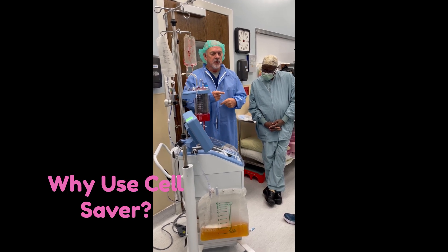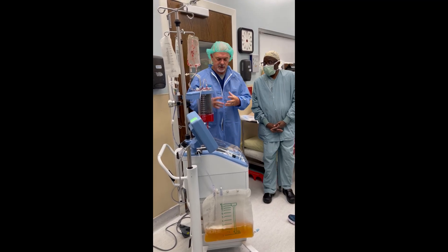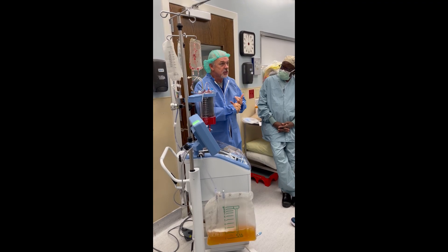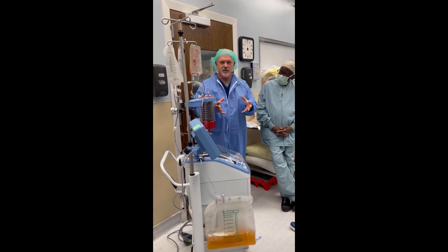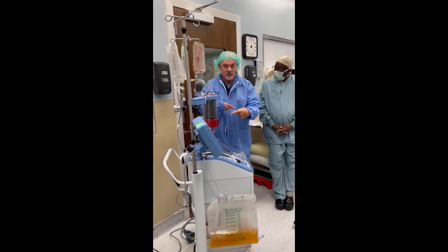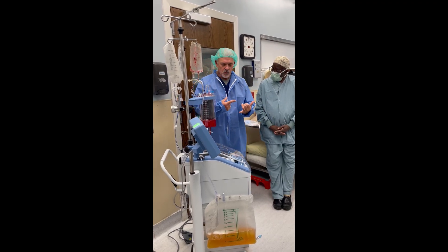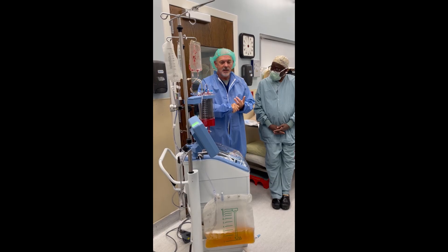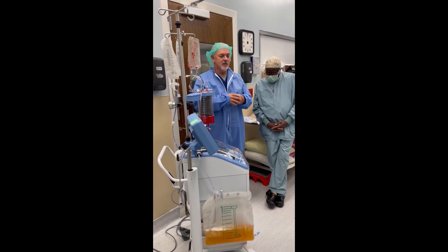The real value of cell saver blood versus bank blood: number one, from the patient's standpoint, it's their own — nothing safer than your own. And you've got fresh blood, so it's got that 2,3-DPG, which is that oxygen-carrying component. That's different from your banked units. Banked units cost $500 to $600 per unit; this is about $120 all in, and you can give unit after unit on that $120. With banked units, the 2,3-DPG is depleted very quickly. Most of the time, blood given back is between 14 and 21 days old, and that 2,3-DPG has been depleted by then — there are a lot of papers that talk about that.